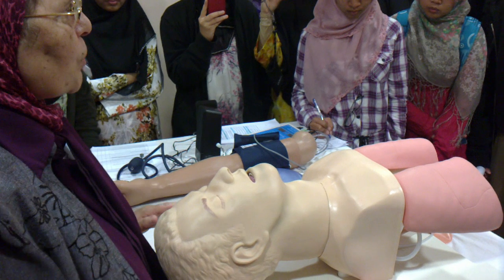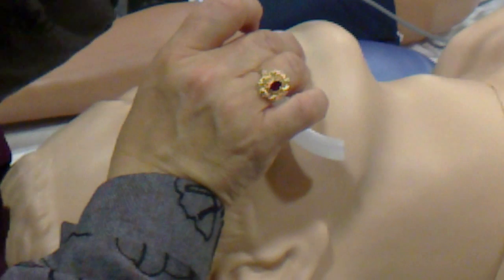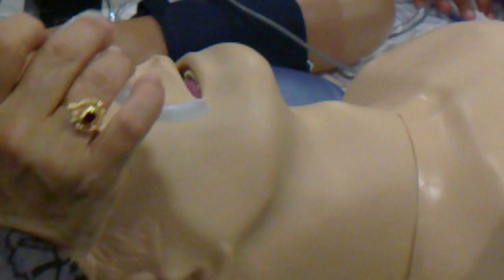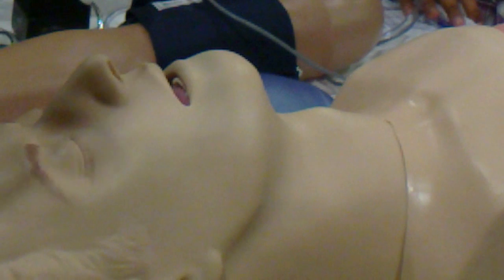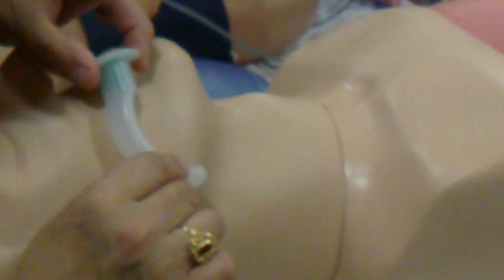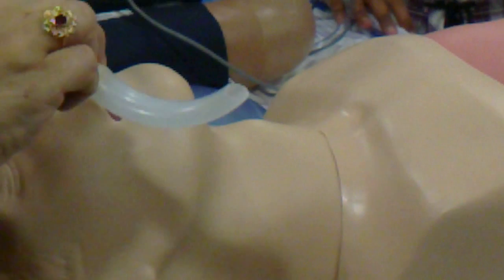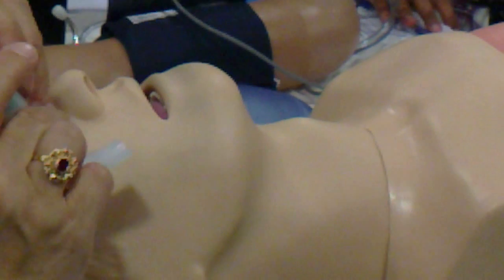So, first of all, you will take a small size, put it like this, so the examiner will see that you are understanding what you are doing. Okay? Without speaking. This is a small one for myself. Okay? This is large, long. This one is suitable. In some mannequins, this one is suitable, or this one; the difference is 1 centimeter between the two. You have to measure and choose the perfect one.